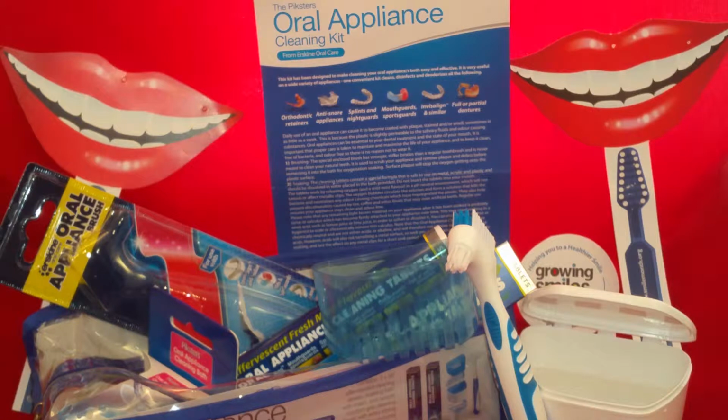So again, we're going to do the who, what, where, when and why. So all of the above as far as who goes. If you've got an appliance that needs to be kept clean, it's going to go inside your mouth, so it needs to be clean. And these things can get quite smelly as well as dirty.